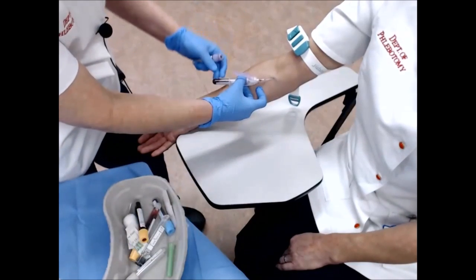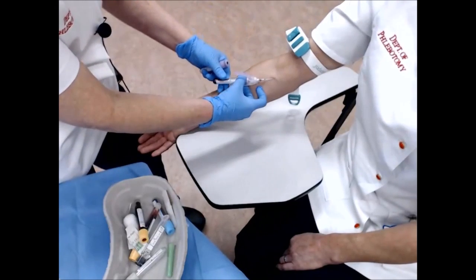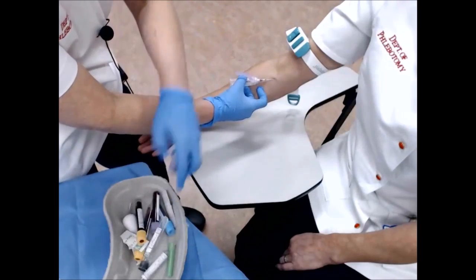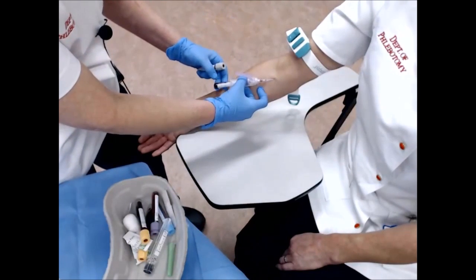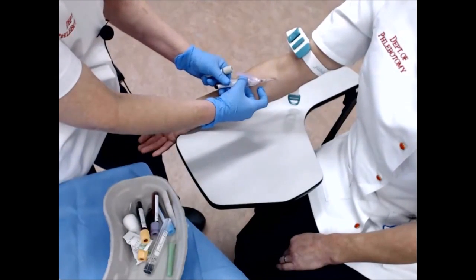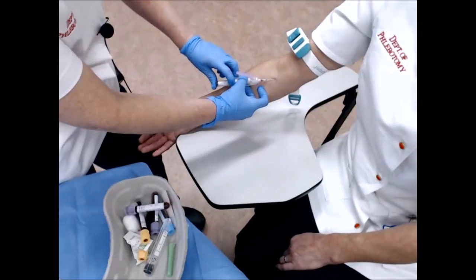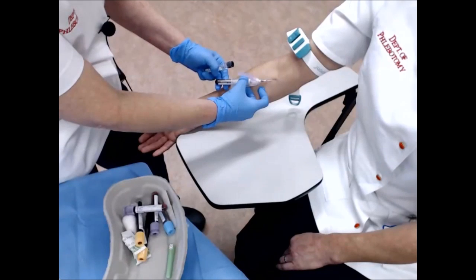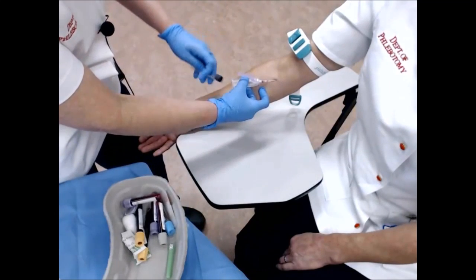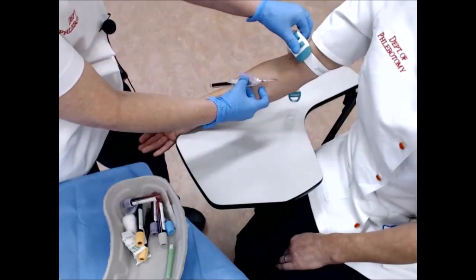Then the lavender top tubes, then the glucose, and finally the ESR, ensuring that the ESR tube is completely full.